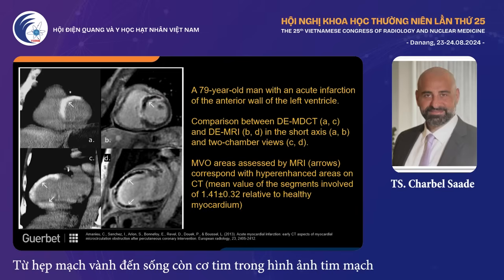So here we can see that CT is still not viable for cardiac microvascular obstruction relative to cardiac MRI. I still think cardiac MRI is the gold standard.